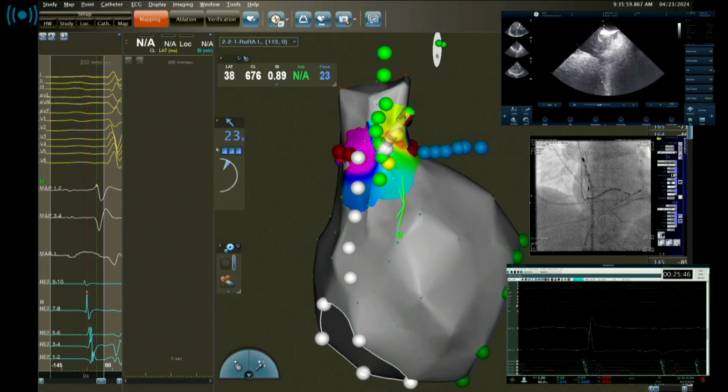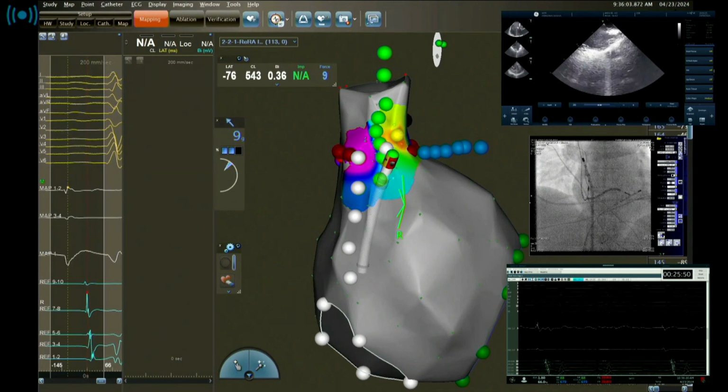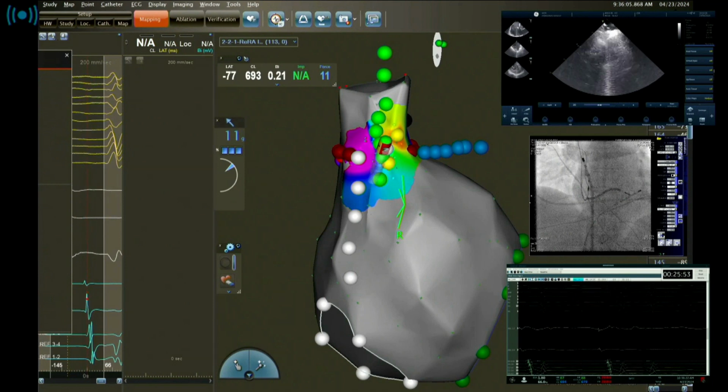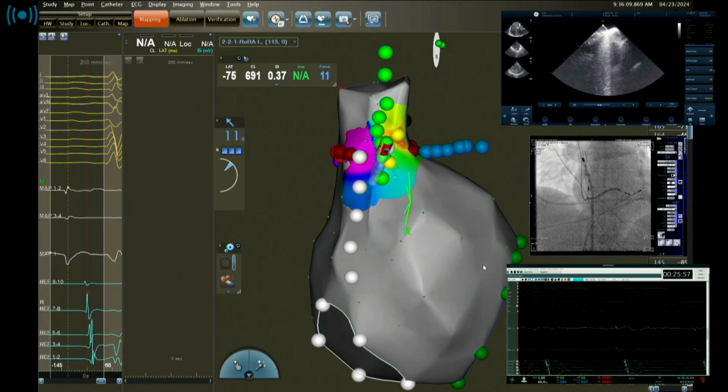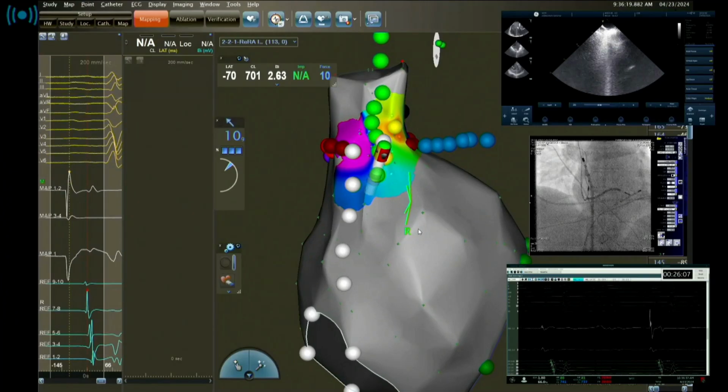No. You see again intracardiac echo. So we go for where is the crista terminalis, where is the sulcus terminalis, where is your ablation catheter, where is the contact with the tissue, so you can really rely on real-time anatomy. This is not virtual reality, but this is reality. So you see everything. You control the situation.